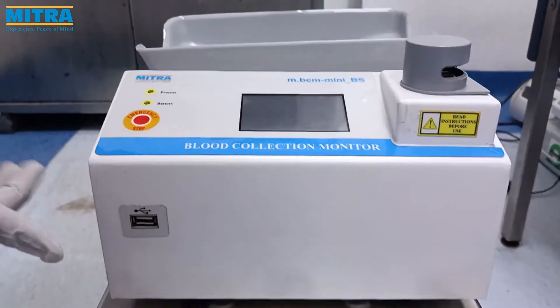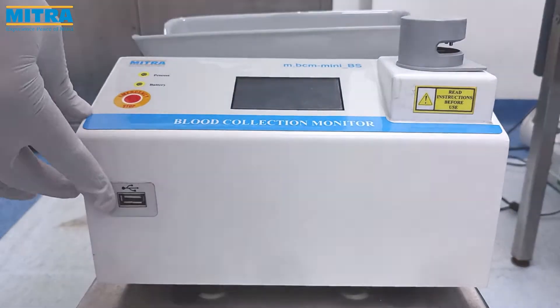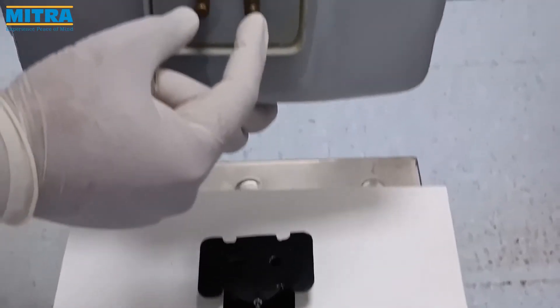This is the USB port which is used to store the donation history on a USB drive. This is the magnetic couple tray with two magnetic screws.